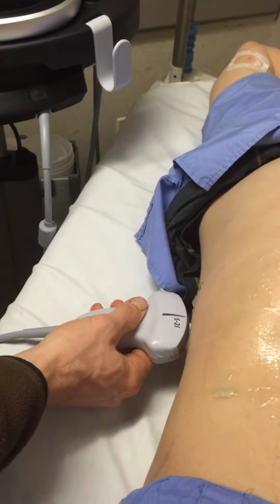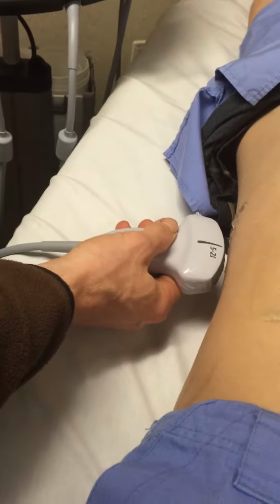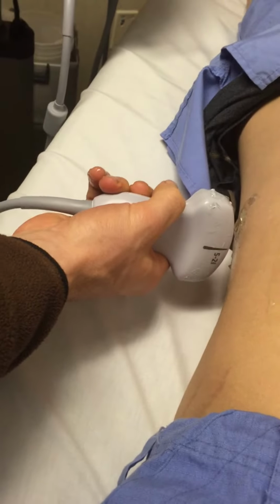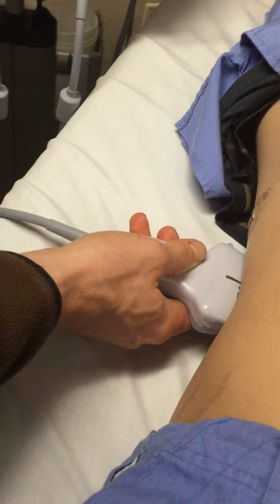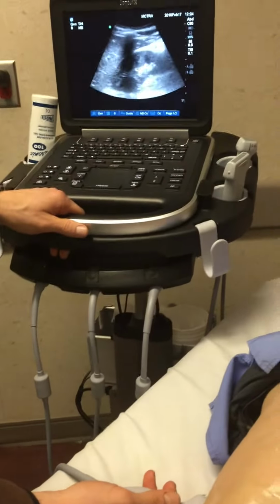We're going to review image acquisition for the FAST exam. You can start in any quadrant. Typically most start in the right upper quadrant or Morison's pouch. You do a longitudinal or sagittal approach, and ideally you want to catch the inferior and superior pole of the kidney. So you can see here I'm just kind of sliding back and forth.